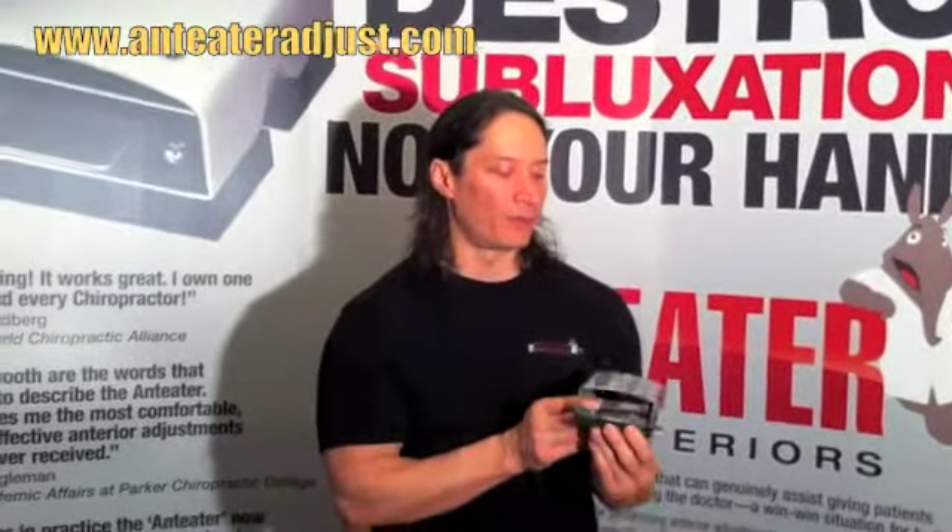Along with the very efficient design of giving the patient a thorough adjustment with less force needed and no harm to the doctor's hand, the other wonderful benefit is instant feedback knowing whether you got that spine to audible or not. Buy one today.